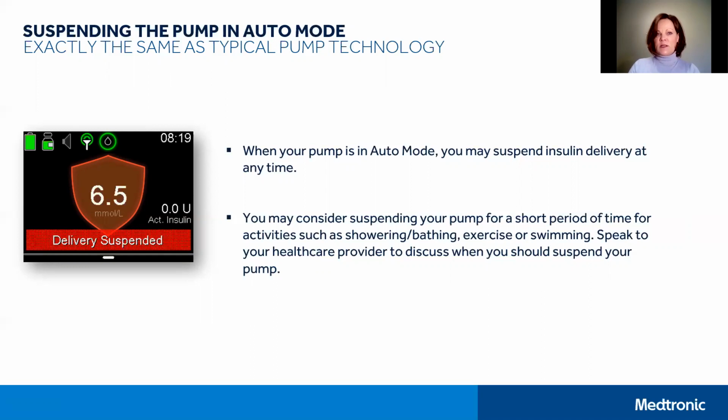You may wish to consider suspending your pump for short periods of time for things such as showering or bathing, exercising, or swimming. And anytime your pump is disconnected and suspended for a period of time, auto mode will then track the correct amount of insulin you've received. It's recommended that you discuss the use of the suspend feature with your healthcare professional.